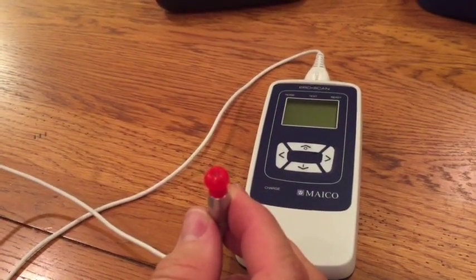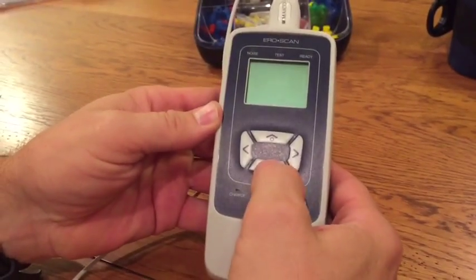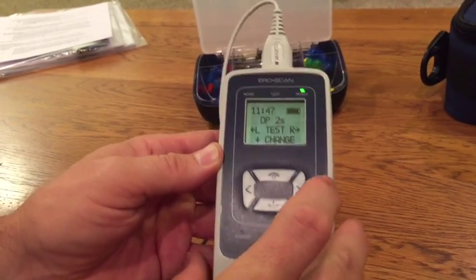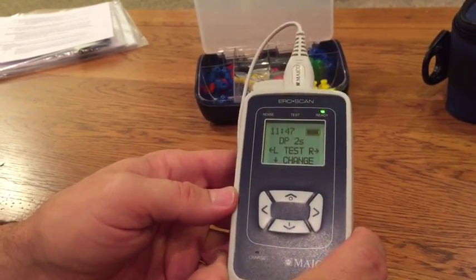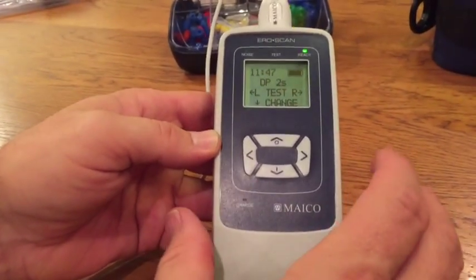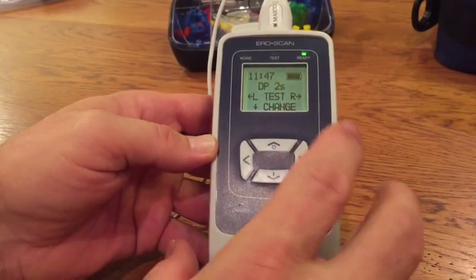Now let's do some exercises in testing yourself. Clip the cord on and place the probe firmly into your ear. Turn the machine on by holding the down arrow. This time, we want to demonstrate internal noise — noise generated from the person being screened. I'm screening myself and I'm going to talk and count while the screening is done, so watch both me and the screen.